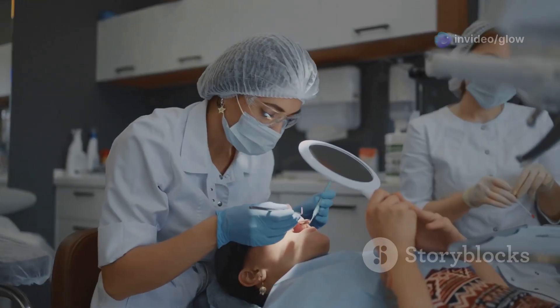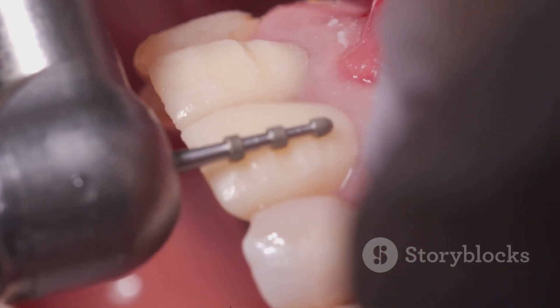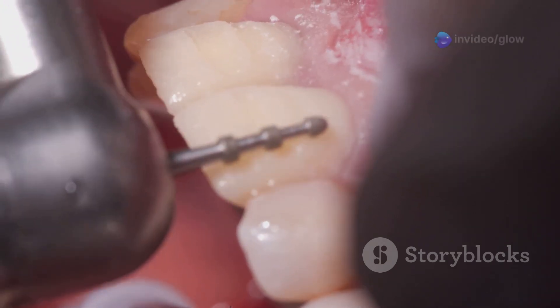Step four: convenience form. Here's where you make your life easier. Shape the cavity for better access and visibility. Trust me, you'll thank yourself later when you're removing all the decay and filling it up.